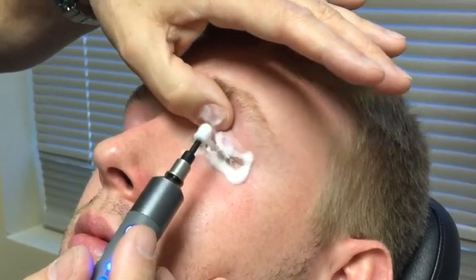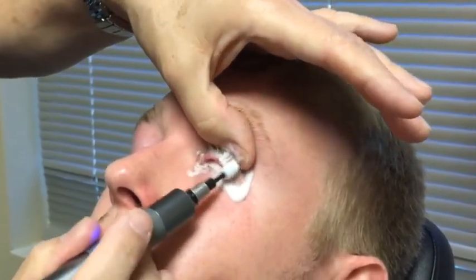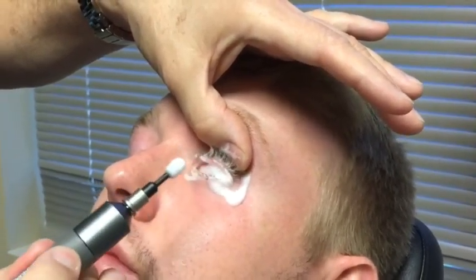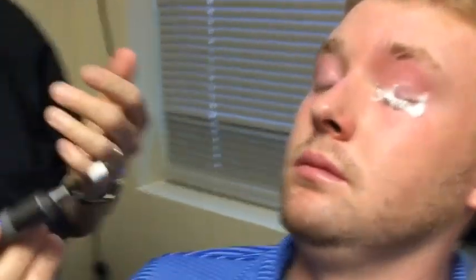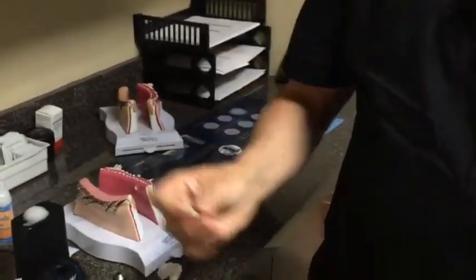Sometimes you'll need to reposition. So if you have to go over here and pop it out, if you have to go over here and pop it out, exposure is key. And we push it again, and that eye's done. Now we're going to remove this tip. We're going to toss it in the trash. And we've just completed a BlephEx procedure on this patient.